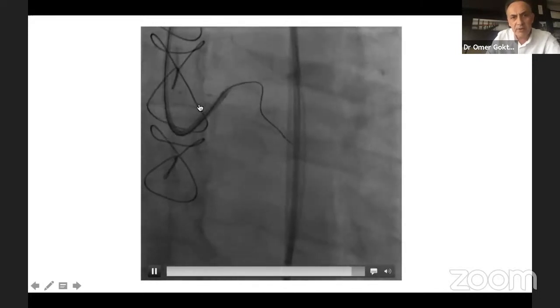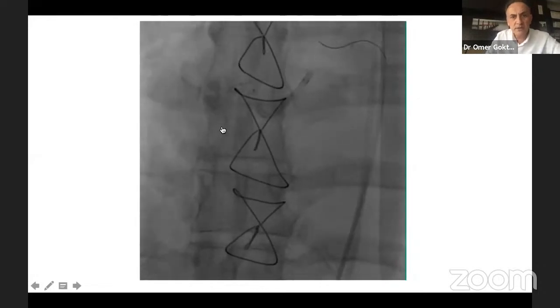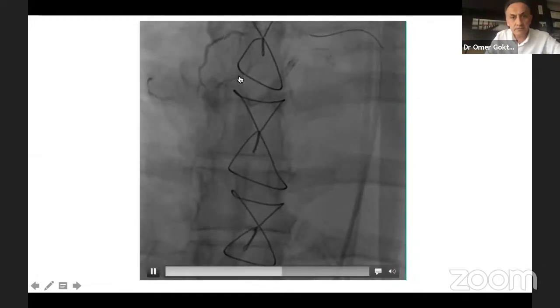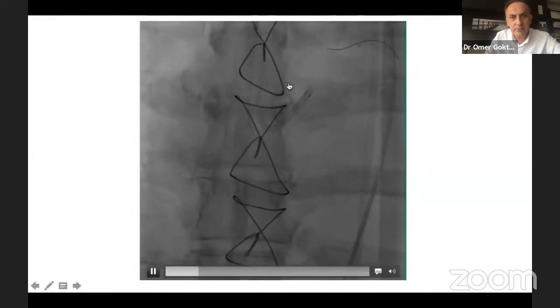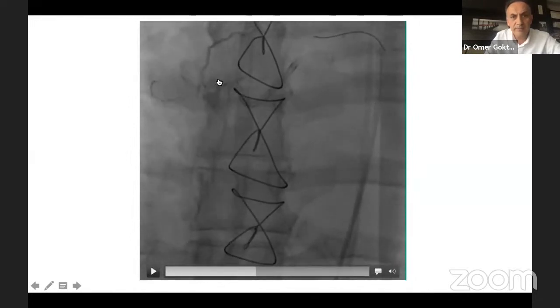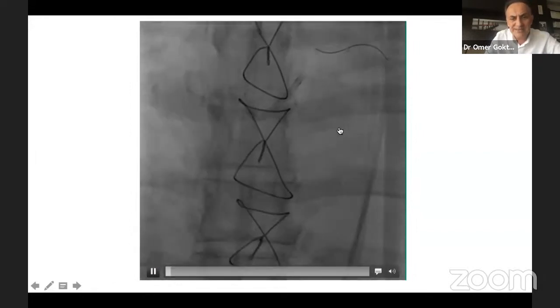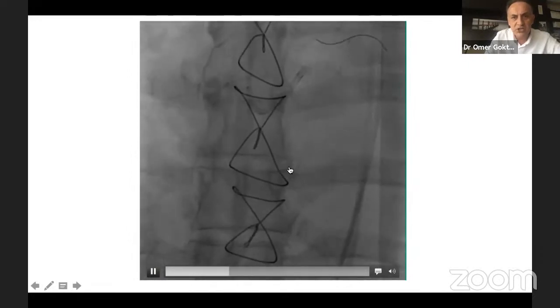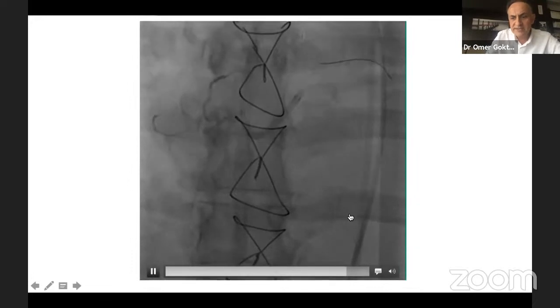I sent a balloon here to have anchoring. Anyway, we try from antegrade. Here you see this is the one that's a branch. It goes after tip injection. It seems that it's difficult, but you will see that tortuosity is not that much, and we went to distal easily, distal to CIRC.